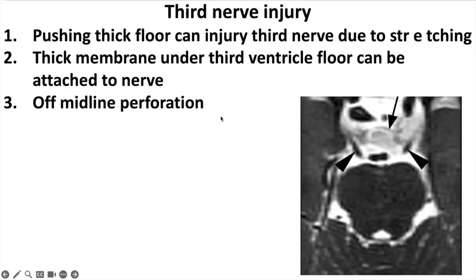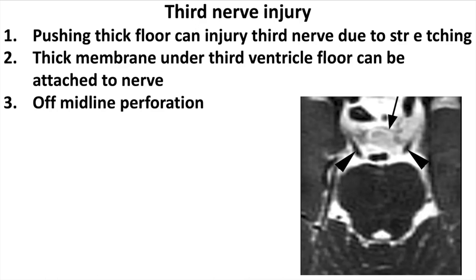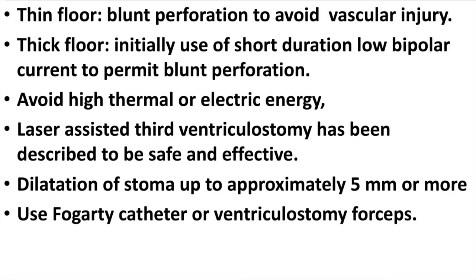There may be various causes of third cranial nerve injury in ETV. Pushing a thick floor can injure the third cranial nerve by stretching. A thick membrane under the third ventricle floor can be attached to the nerve and injured during off-midline perforation. If there is a thin floor, use blunt perforation to avoid vascular injury. If there is a thick floor, one can initially use a short duration of low bipolar current to permit blunt perforation. One should avoid high thermal and electric energy.